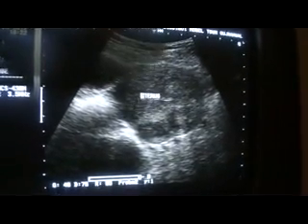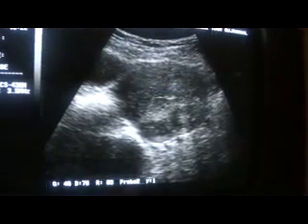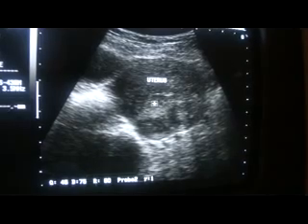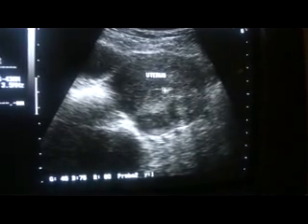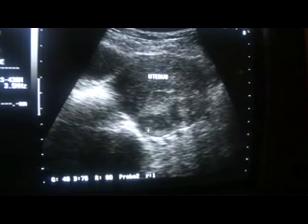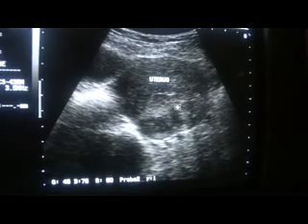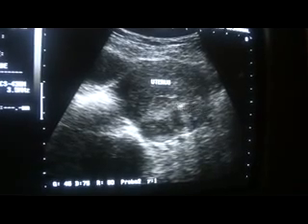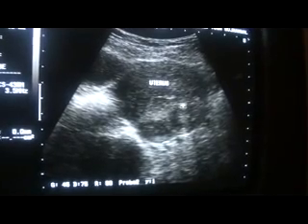So this is a study of an enlarged and bulky uterus with multiple bullseye appearance to hypoechoic focal mass, solid focal mass lesions, along with many subserosal fibroids, hypoechoic.